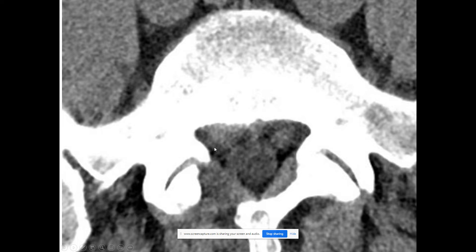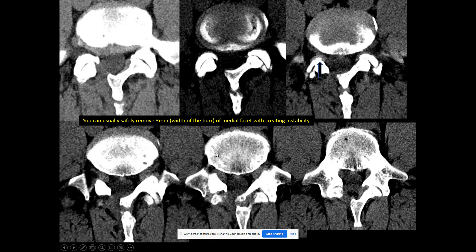Just a case of S1, L5-S1 foraminal stenosis. Here's the S1 nerve root on the opposite side. The offending mechanism is the sacral portion of the facet joint at L5-S1. One must also always remember that the facet is made up of bone but also of capsular tissue, synovial tissue, which may be compressing the nerve root in the foramen.